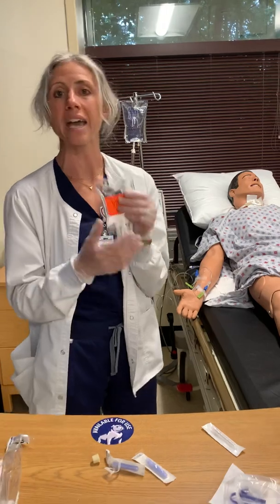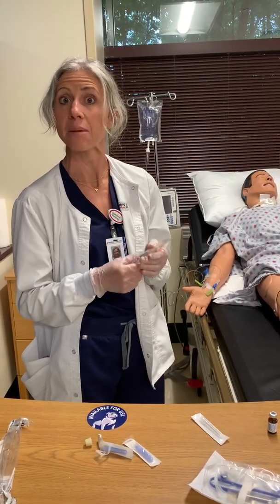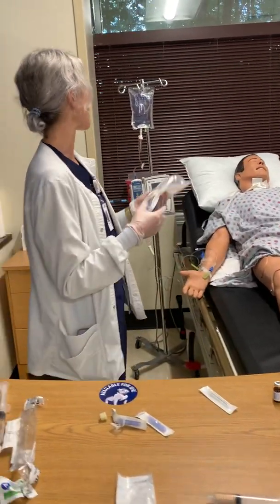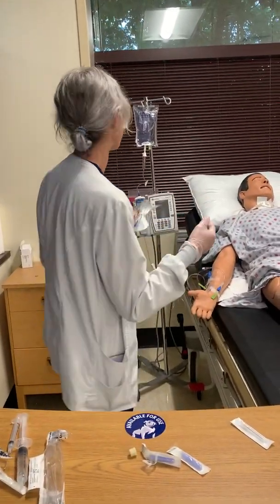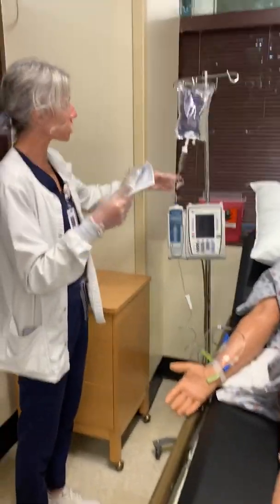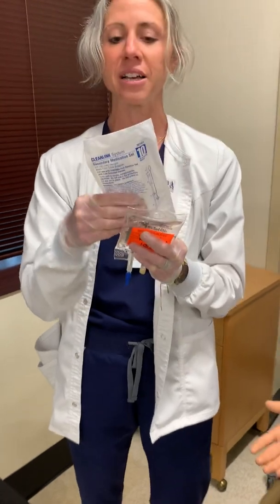Now in this case, we're going to be hanging what's called a secondary. You'll hear the words piggyback, secondary. They mean the same thing. Now what May hung was called a primary. That was our primary fluid. So most often, you need to see the difference when you're running in and scrambling to get all of your supplies, make sure that you have the right tubing. What does this say on there? Secondary medication set. Okay, that's my secondary.